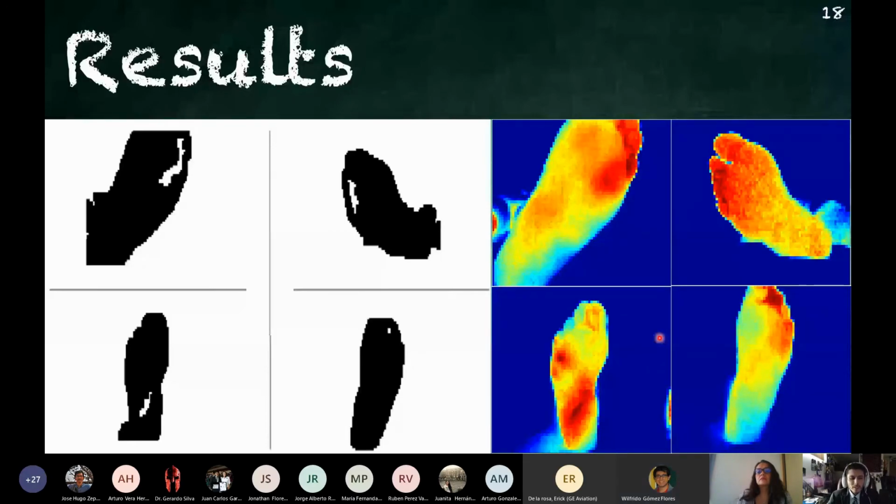Yes, actually, because the narrower the area, the more we can retrieve only the temperatures that are related to the abnormal temperature region. If I make it wider, I would have more data, more pixels that are related maybe to regions that correspond to the normal temperature behavior. So I try to make it as narrow as possible, on purpose, to only retrieve the temperatures that, for example, we can see in the third image, are only related to the most red area.